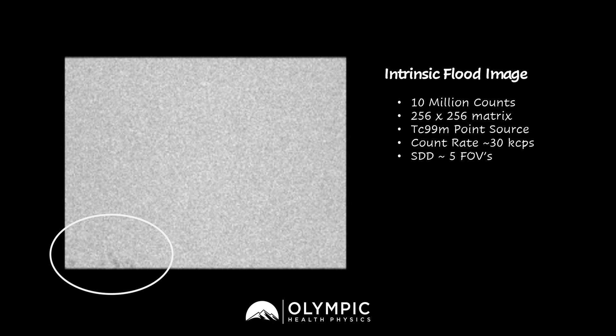This is a fairly nondescript artifact. It doesn't have very defined or geometric shapes to it, so we can rule out things like PM tubes. The next step in diagnosing the problem with this system is to do off-peak images. Off-peak images allow us to evaluate the gamma camera for things like PM tube imbalance or PM tube decoupling.